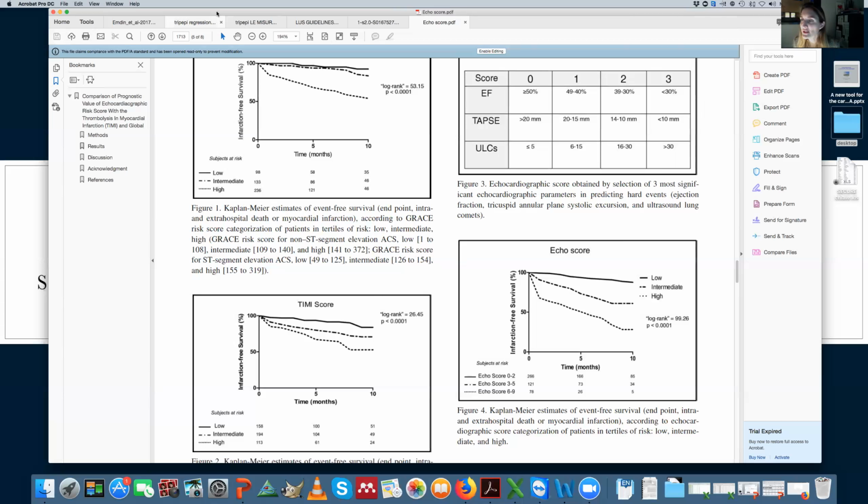Because in the studies that I showed you, some of these studies included both patients with preserved and reduced ejection fraction. And I can tell you, I have an analysis of my data dividing these two categories of patients, and there are no differences in the behavior. So no matter what your ejection fraction is, no matter what the cause of heart failure is, the B lines are present when you are decompensated, and they decrease during the hospitalization, and the ejection fraction is not relevant here. It's the degree of extravascular lung water which is relevant.